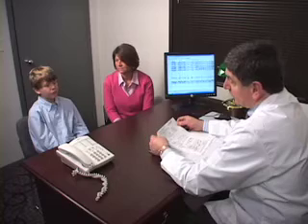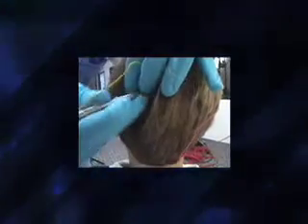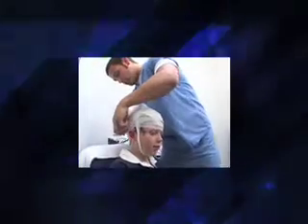When referred to a neurologist for a potential seizure disorder, the physician will examine you and obtain your medical history. If the physician feels that diagnostic testing is warranted, a DigiTrace Ambulatory EEG test may be ordered. This is an accurate way to diagnose both epileptic and non-epileptic seizure disorders. Diagnostic EEG testing can be done on an ambulatory or at-home basis.